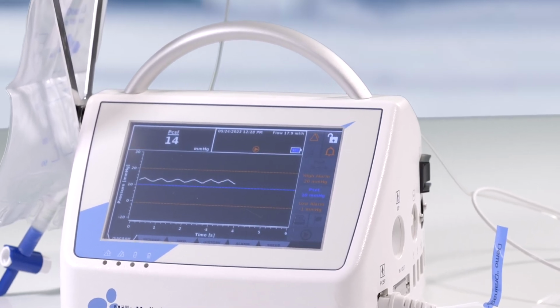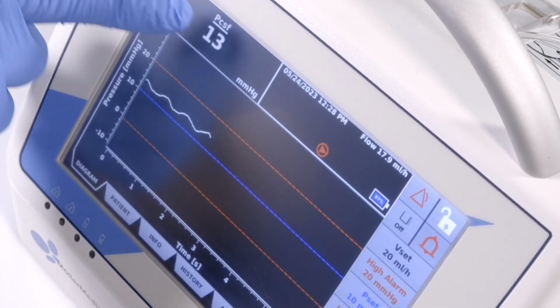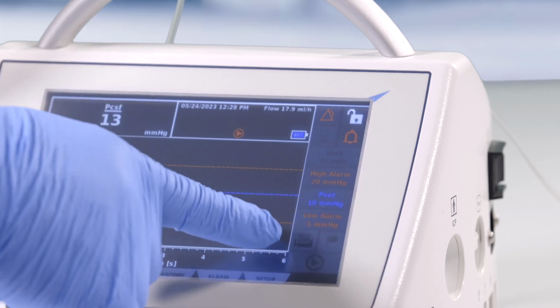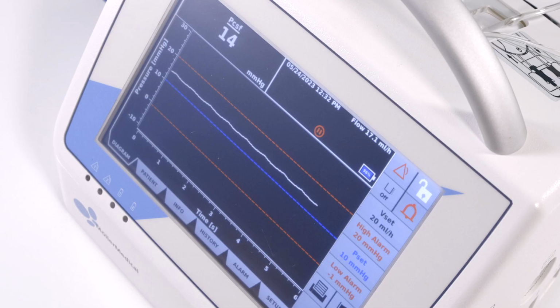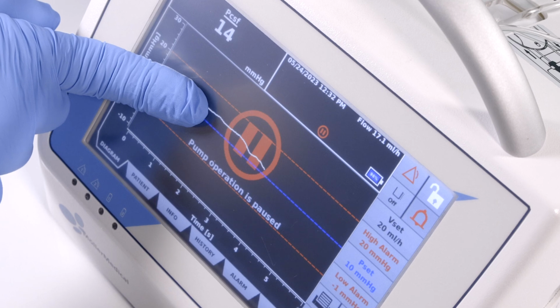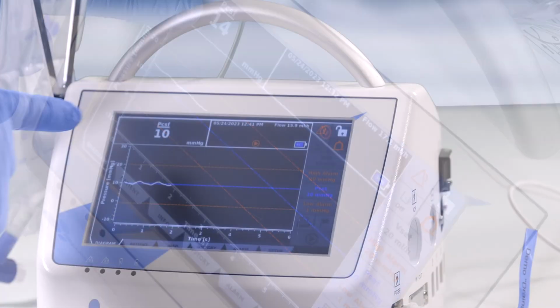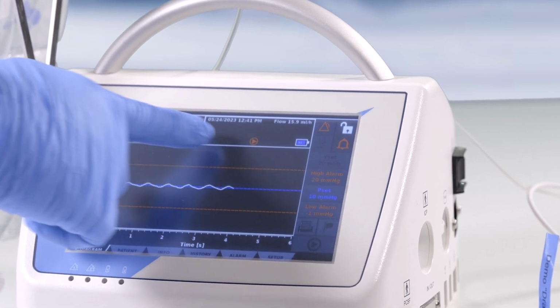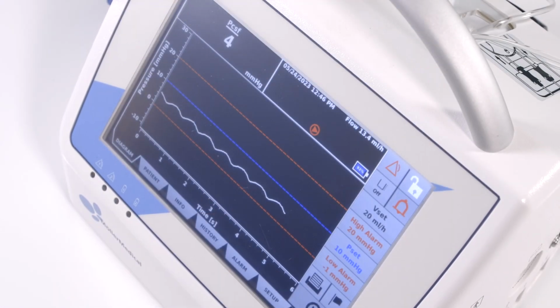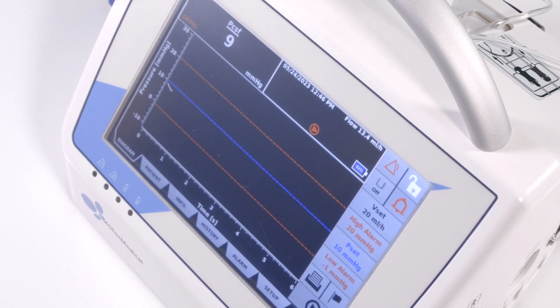Liquoguard automatically drains CSF at a user-defined flow rate, whenever the patient's CSF pressure is greater than the value of P set, and the device is not in pause mode. When in pause mode, Liquoguard continues to measure the patient's CSF pressure, but will not drain CSF. When the patient's CSF pressure is at the value of P set, or when the CSF pressure drops below P set, Liquoguard automatically stops draining CSF.